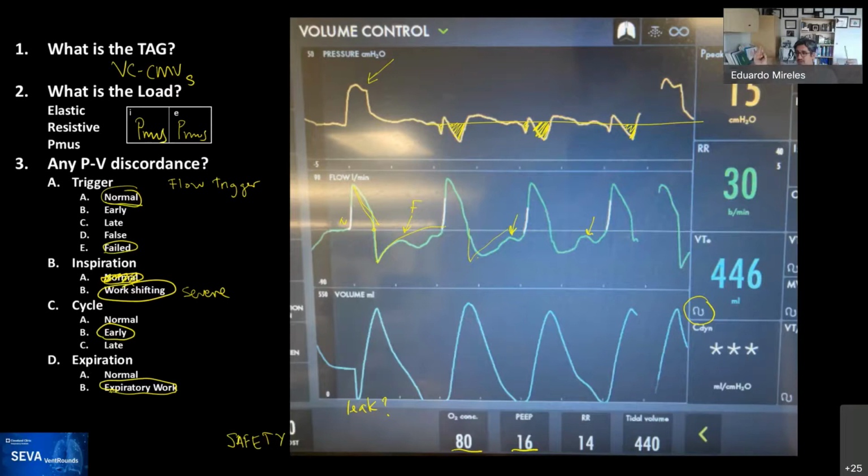As you have heard me say before, there are many modes in the world and you use them according to what you think. So just type in what you think would be the mode that you would put this patient on. As you see it now, 80% FiO2, PEEP of 16. You don't have paralytics. You cannot sedate him further. Would you change the mode?